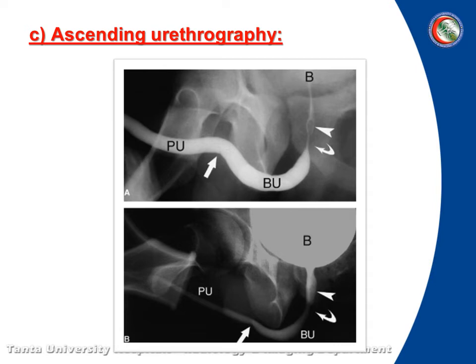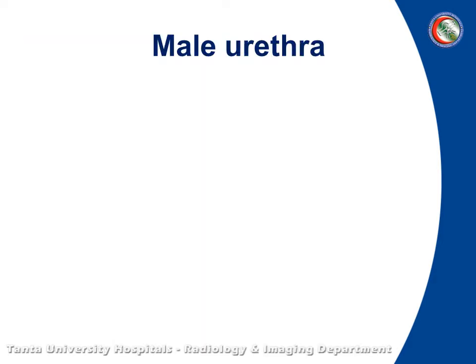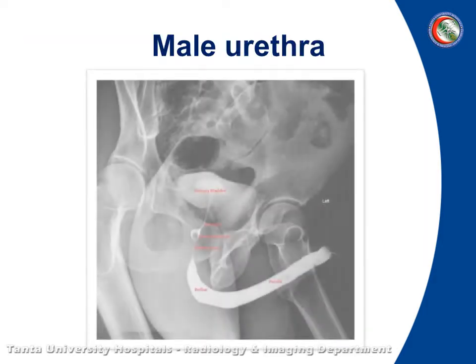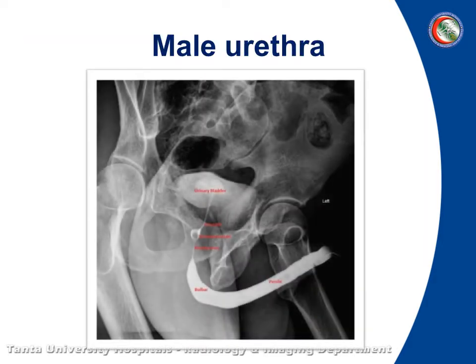On ascending urethrography, there is also complete opacification of the urethra with no stricture, no filling defect — male urethra. As you can see, the whole course and the whole parts with no filling defect or abnormal stricture.